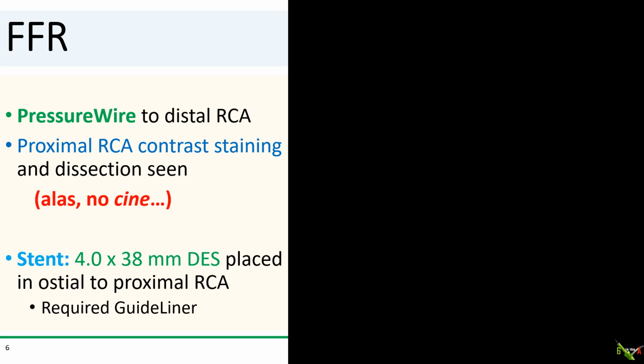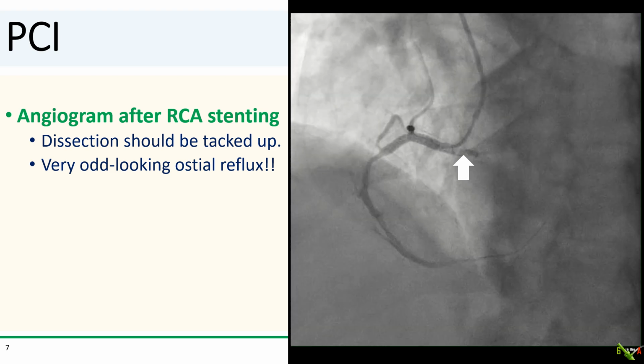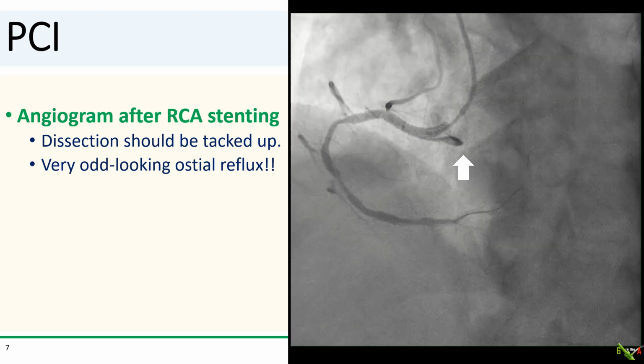It was a little bit challenging, but we were eventually able to place a 4.0 by 38 millimeter DES from the ostium, hanging a little bit in the aorta, into the proximal RCA using a GuideLiner. So here is what the RCA looked like after the 4.0 millimeter stent went in proximally. The dissection should have been tacked up by the stent, right?